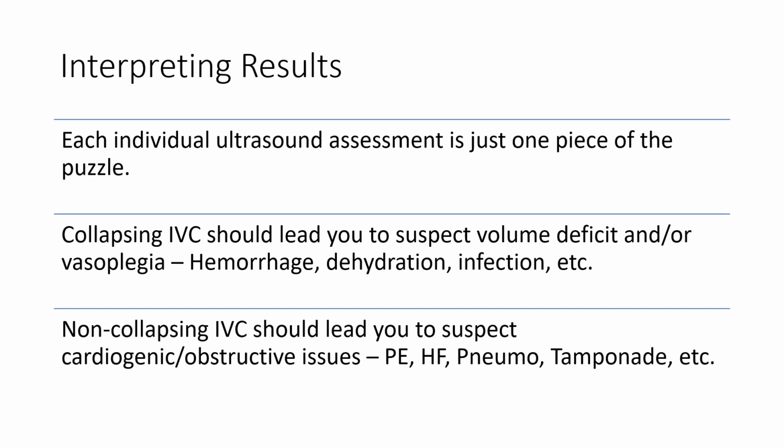So if you're not sure, is it pulsating, that would clue you in that you might be looking at the aorta. You can throw color flow on there and try to help as well. But once you get that IVC in view, you're asking a simple question: is it collapsing or not on spontaneous breaths? I did forget to mention, if the patient's mechanically ventilated, the physics would flip, so the IVC would actually get bigger during the breath in and smaller as the breath out. But it really honestly doesn't matter, because you're just looking at overall change in size, and that's going to be present either way. A lot of the studies were done on mechanically ventilated patients, so some of that IVC collapsibility criticism comes from that fact as well.